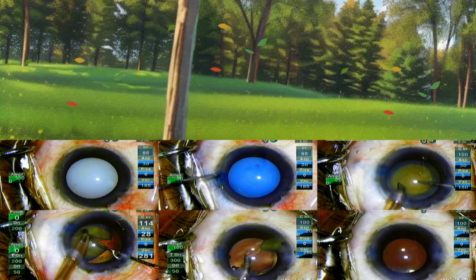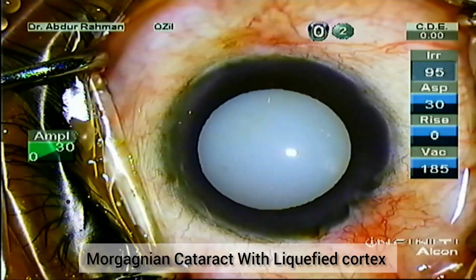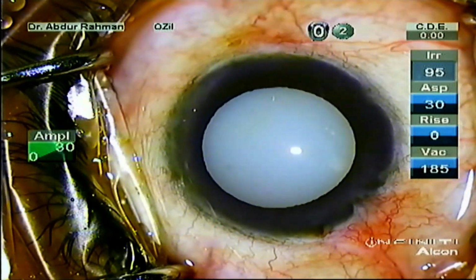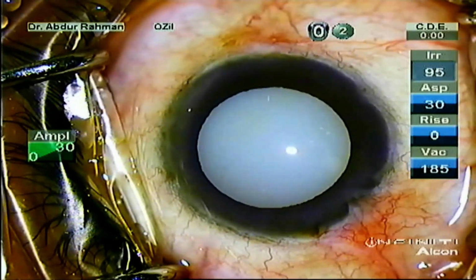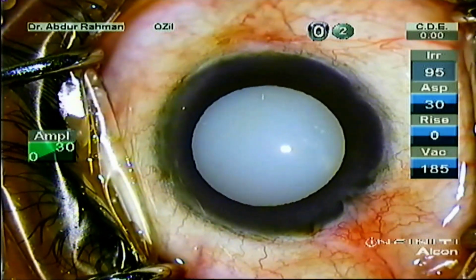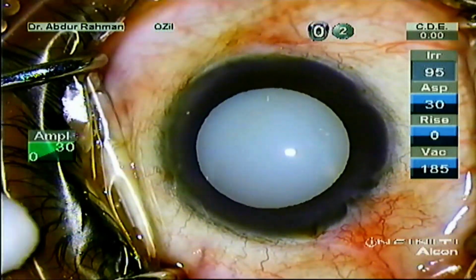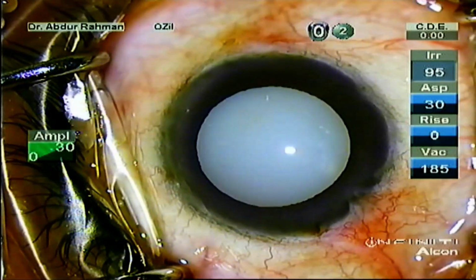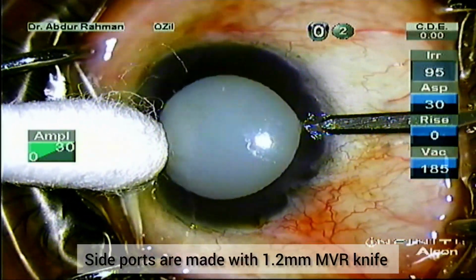I am Dr. Abdurrahman Muhammad Alam, going to perform this surgery in this Morgagnian cataract with a liquefied cortex. This person has a vision of PL and is unable to see with her right eye. I have taken up this challenging case to restore her vision.